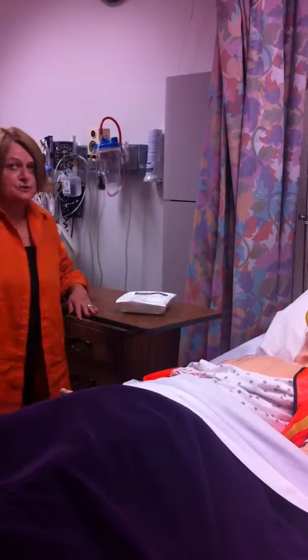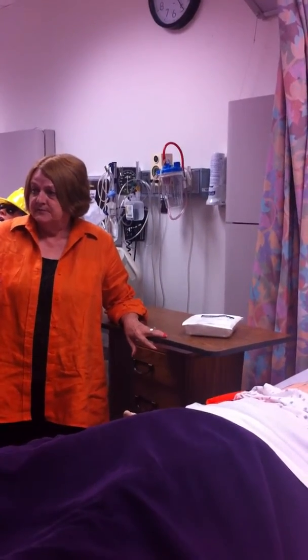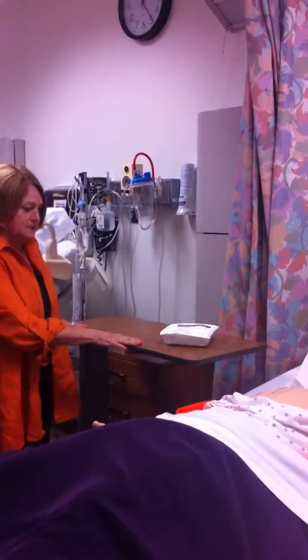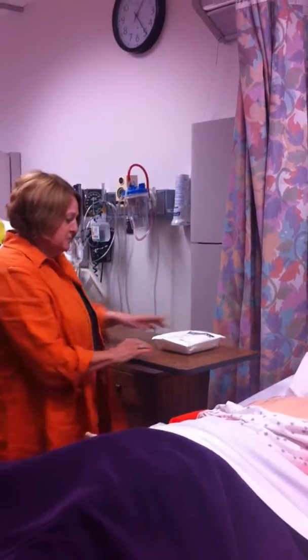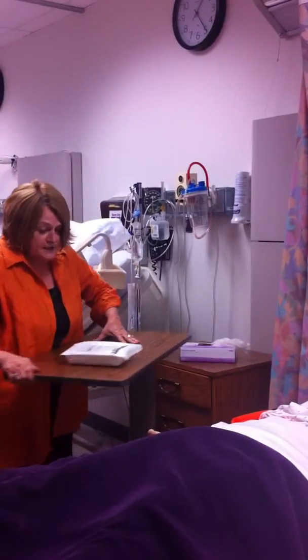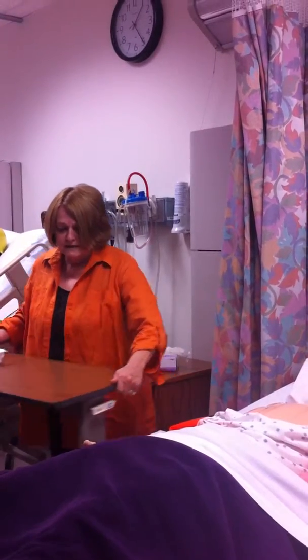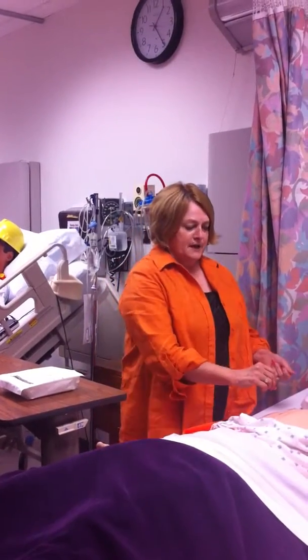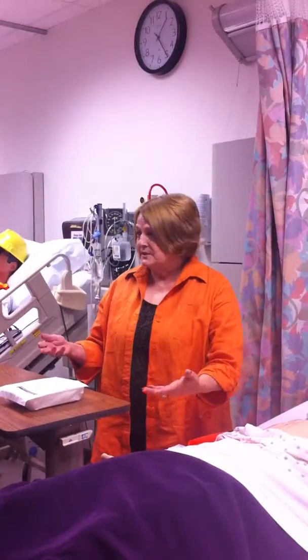Okay, one of the things that you need to become aware of is where do I want my workspace to be? Where do I want my sterile field to be? Because I am doing the dressing change here, I like my workspace to be right there because there is no way I can turn my back on my sterile field if I put it here. If I put it down here, which most of you tend to do for some reason because you forget that this is on wheels, then I have a really good opportunity to break sterile technique by turning my back, see? So think about that before you start. Set yourself up for success.